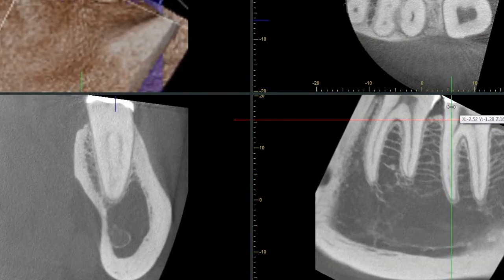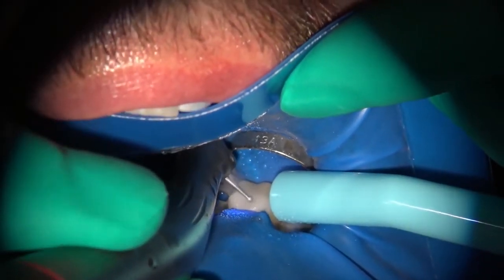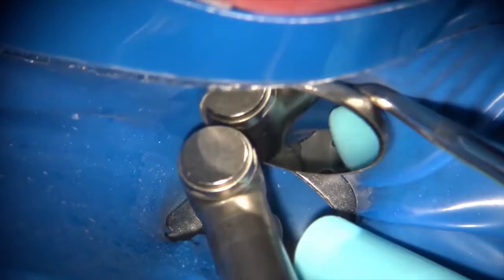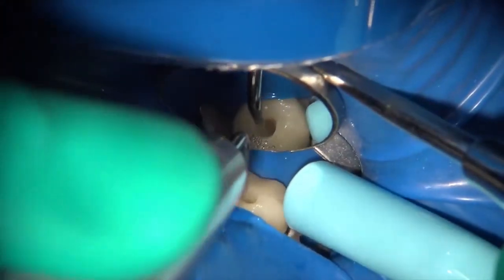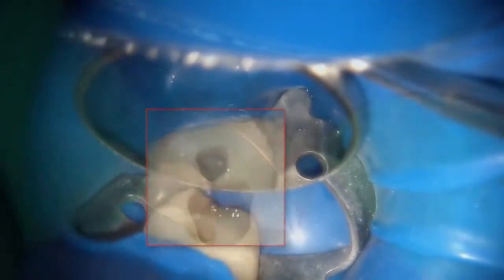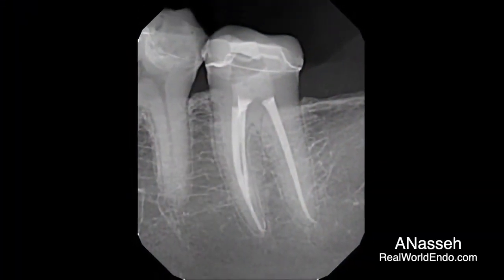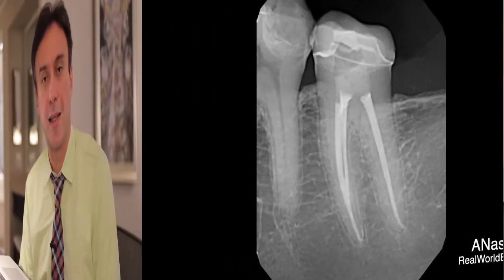You could make the argument that this is information we can find clinically, but in this particular case it may not be all that helpful — I wanted more to demonstrate how long it takes to take an image and interpret it. Now I'm going to show you the case itself. As usual, we always start from a preclinical PA radiograph from which we make our estimated working length, and then make an access preparation through this zirconia crown with our DuraCut Burst from the Real Endo Access Kit. You can see the access preparation, and then the post-op here — it's a pretty conventional type of case with canal joining. That information I had in advance, so I quickly knew where to look for the canals and how to treat them, get to the large enough apical diameter, and get things done.